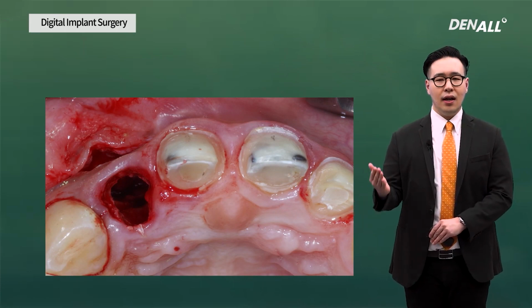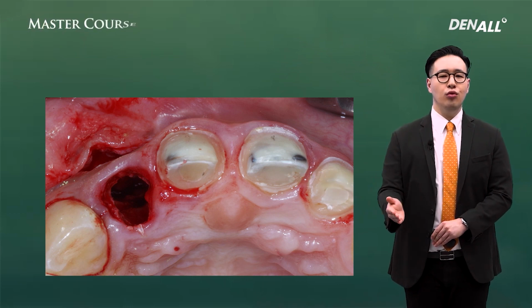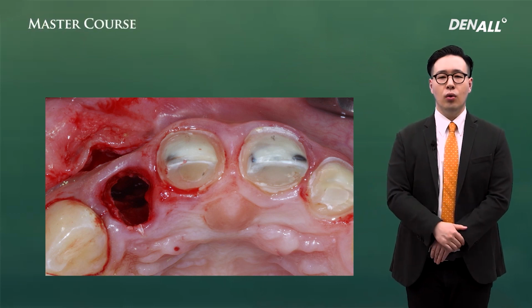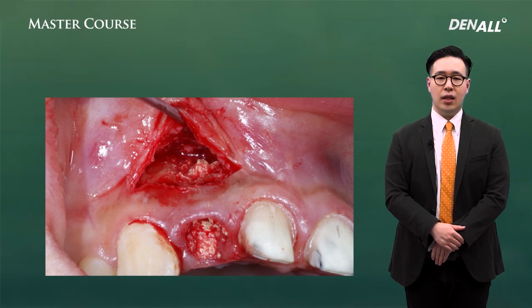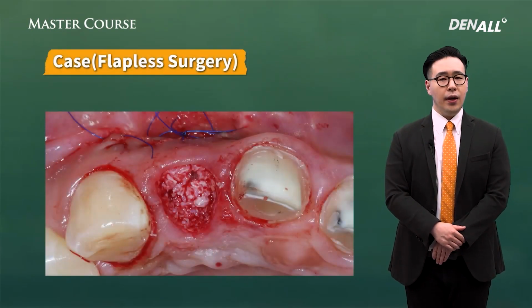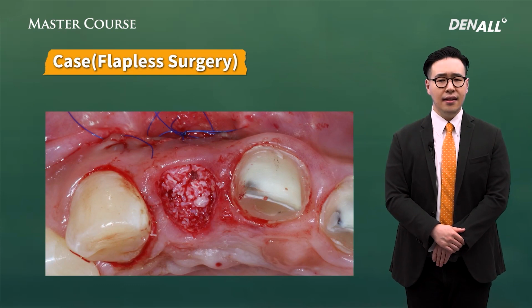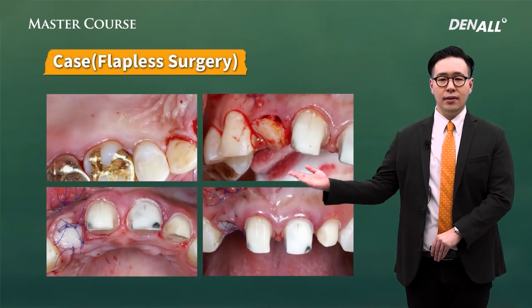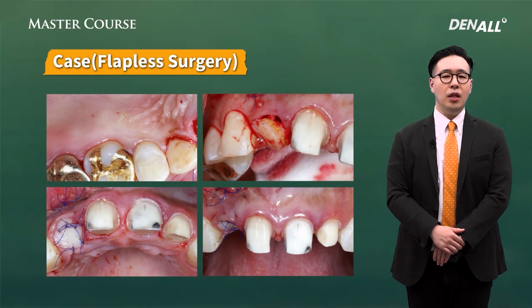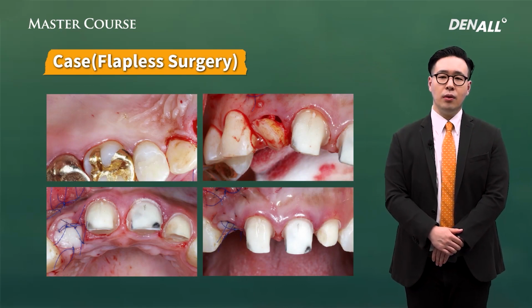Along the scar line, a flap is raised and the inflammatory tissue is removed. Socket preservation is done and the flap is closed. If the plan is not for immediate placement of the implant, the socket sealing technique using round FGG will help for immediate supporting of the papilla and marginal gingiva.